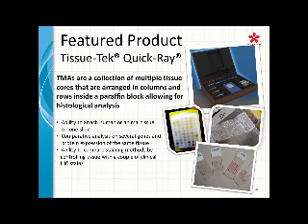Even pathologists sometimes will request blocks to be pulled for old cases that they're looking for. You don't ever really want to increase your epitope retrieval too much when you're doing these blocks because it can actually distort your tissue. But there's a possibility that the antigen may not be retrieved because of the hydrogen bonds creating that kind of block for the epitope to be opened up.